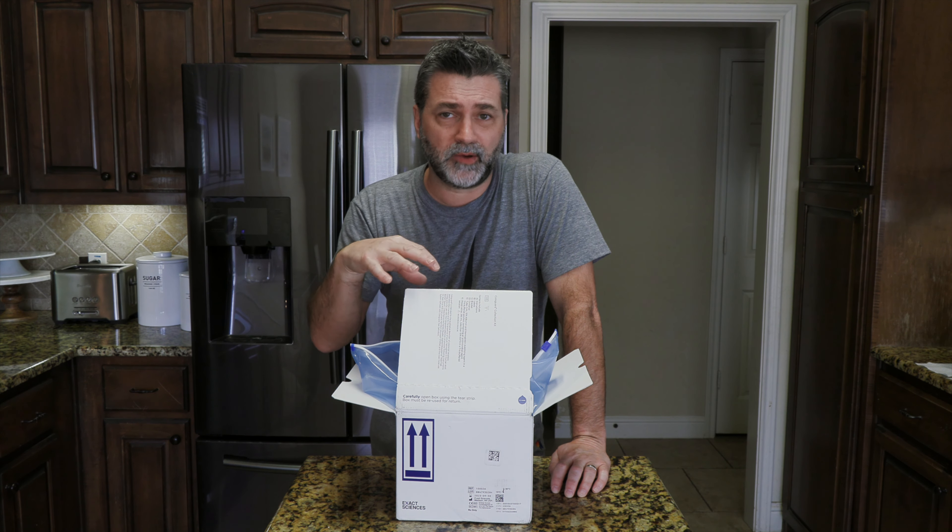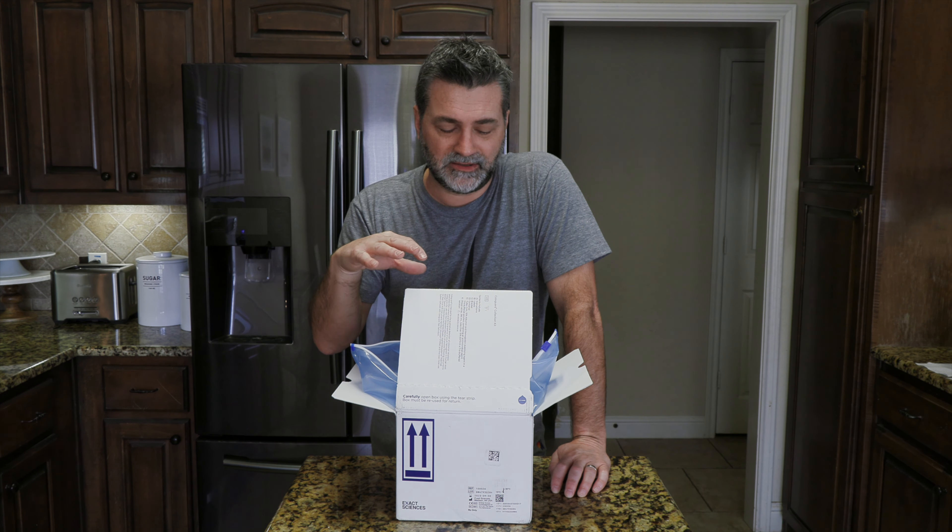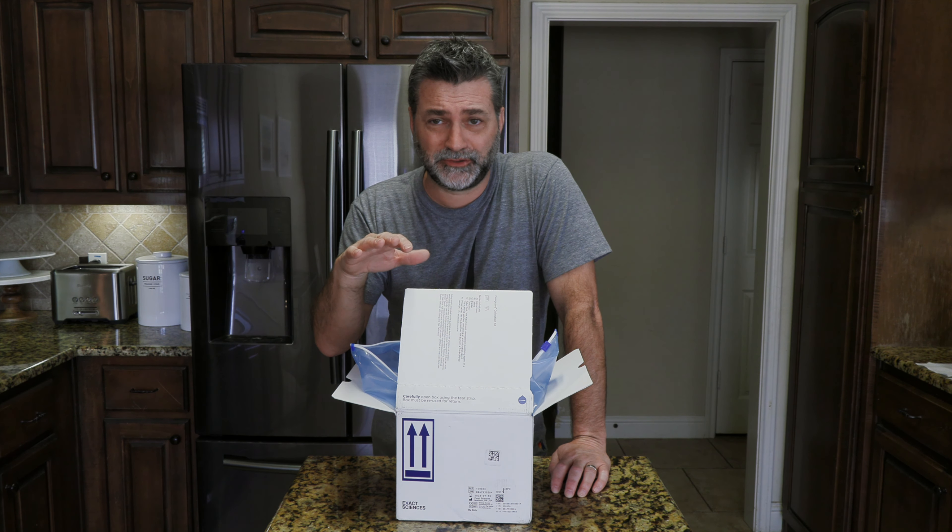So I'm going to do a quick unboxing and show you what's in the box. I'm not going to give you a full demonstration on how it works — I'll talk you through it a little bit, but I'm not going to show you exactly. So this is the box that it comes in. You open it up and it has a guide that shows you how to do it. It's pretty thick — a lot of information.